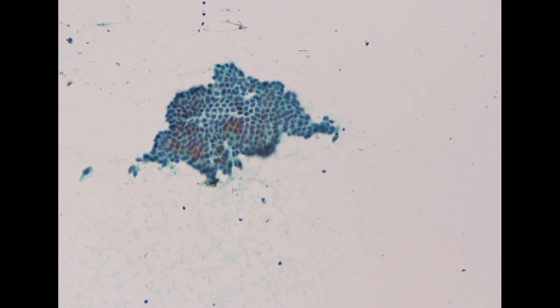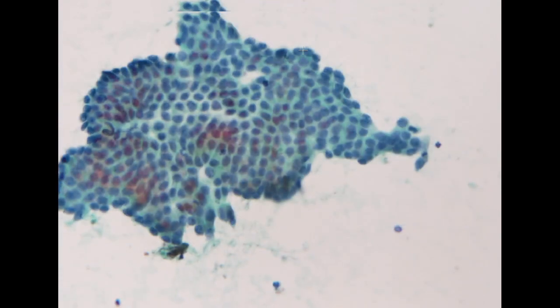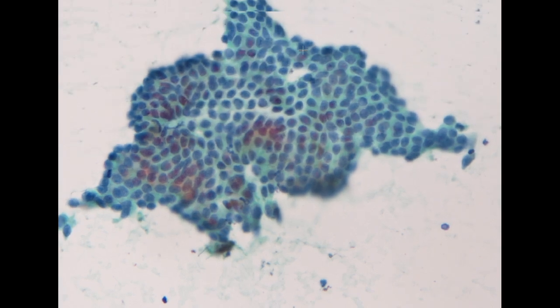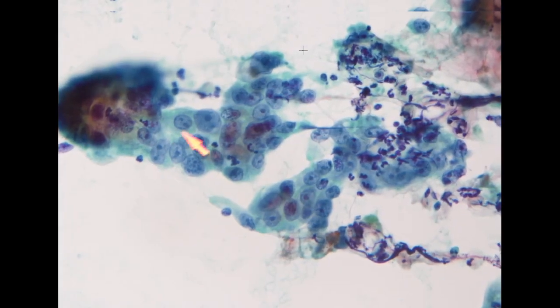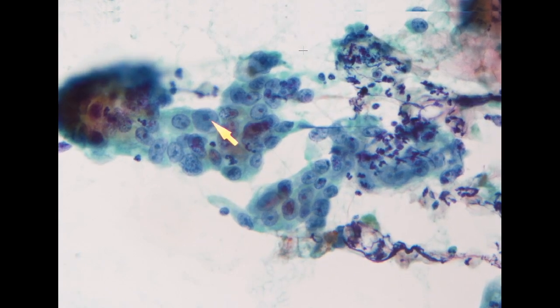So this is relatively benign looking common bile duct mucosa. It shows a nice monolayer honeycombing arrangement. So comparing to this normal mucosa, here we have the adenocarcinoma, which is showing much enlarged nuclei with prominent nucleoli.